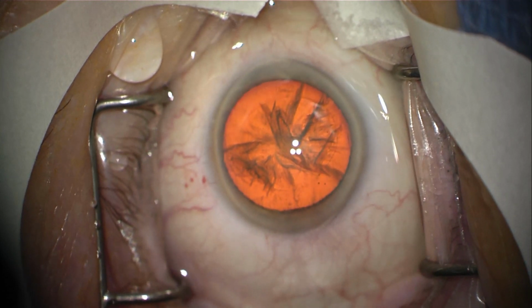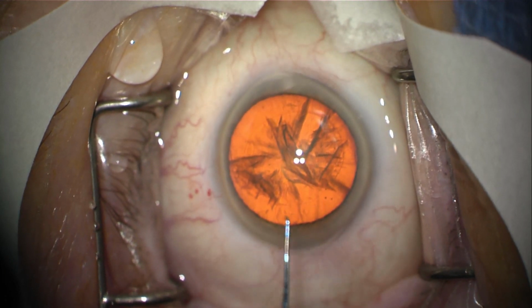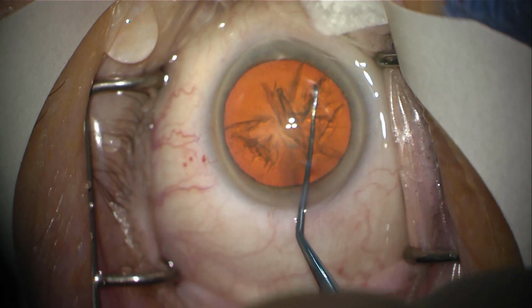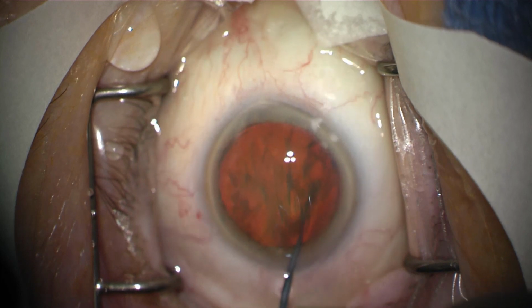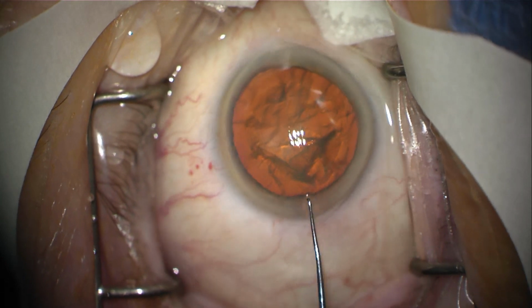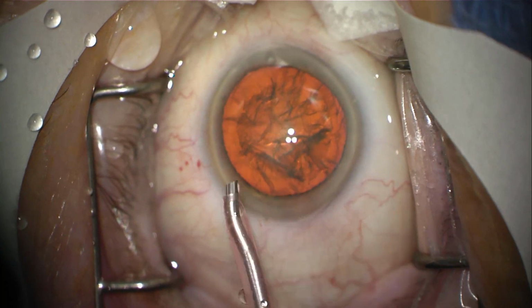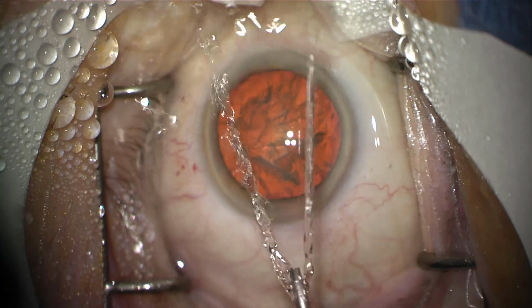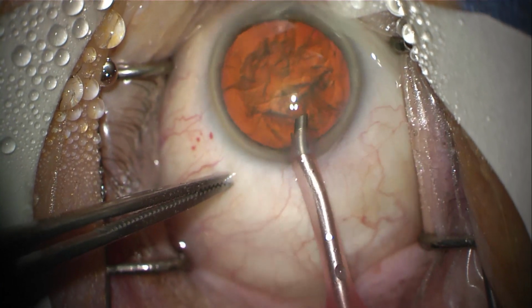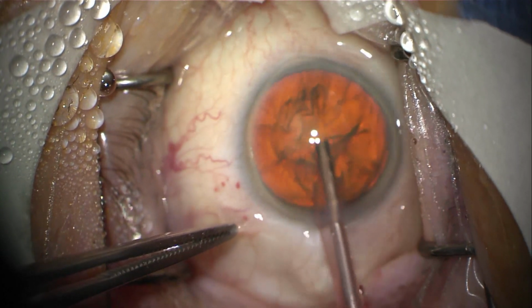It's extremely delicate. What I've done there is irrigated or squirted this solution around the entire cataract, and now I'm going to put in a little hook, and you can see I am able to rotate the cataract inside this very delicate, very thin capsule. That tells me that I've separated the cataract from the capsule. I'm now going to insert a device called a phacoemulsification tip. This squirts fluid into the eye while simultaneously vibrating at extremely high speeds. And what I'm doing is emulsifying the cataract.